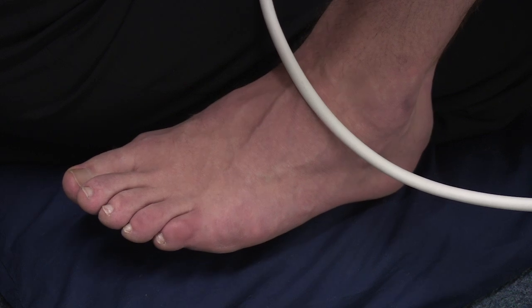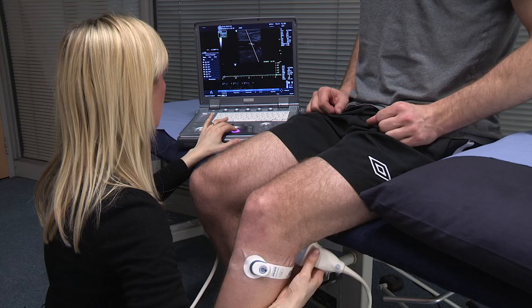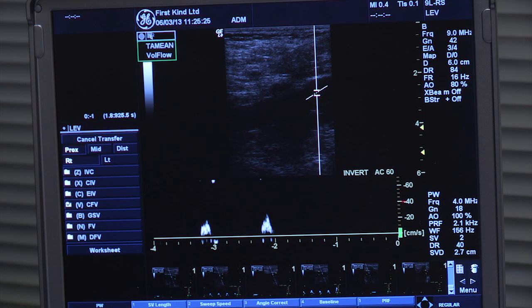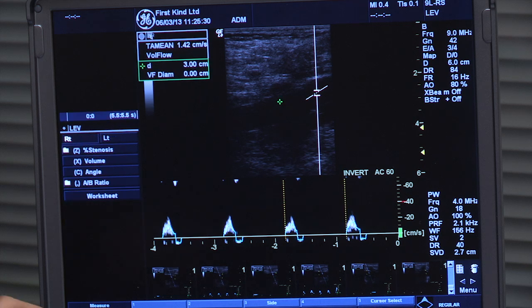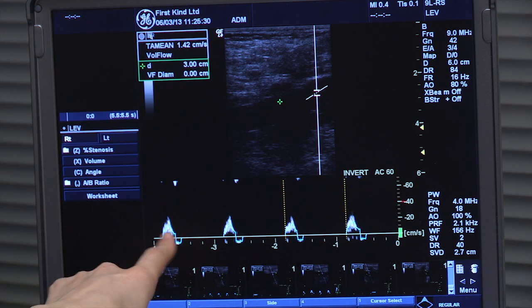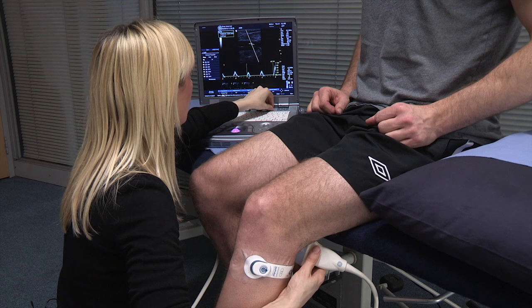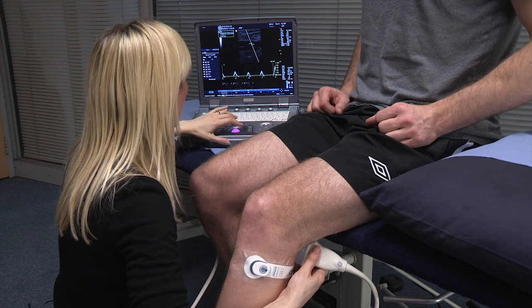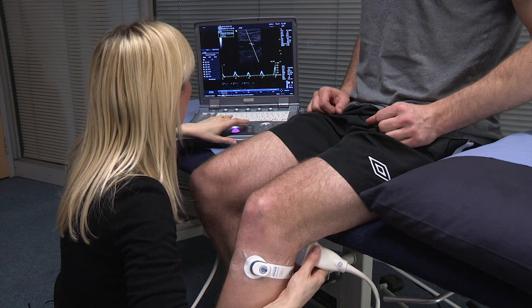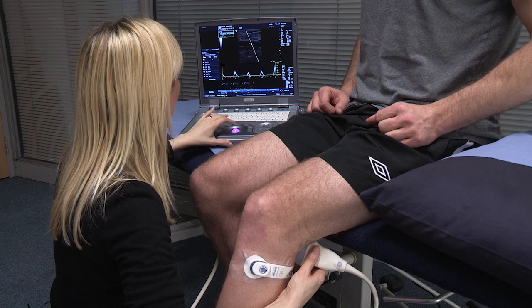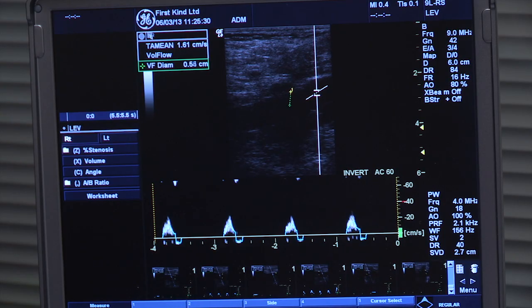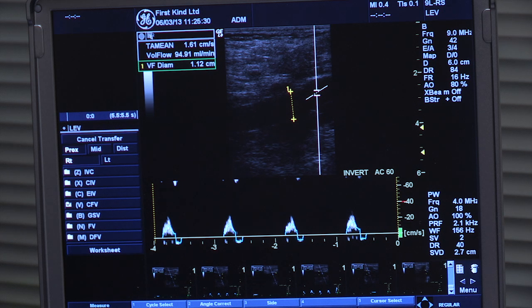We've got a movement of the foot there — just see how much blood volume we get. You can see it looks pulsatile, like it's an artery, but we're still in the vein. I'm going to move over a four second period and set that measure.